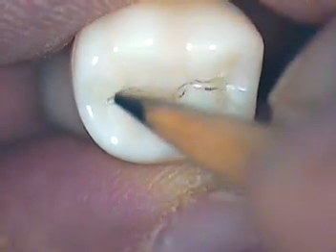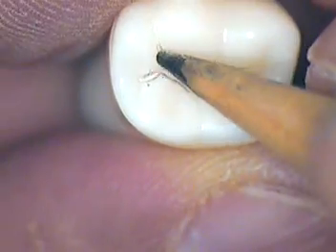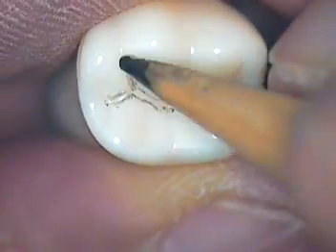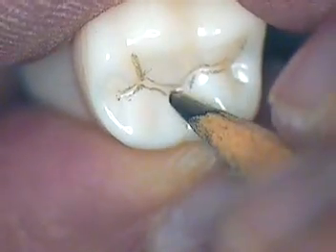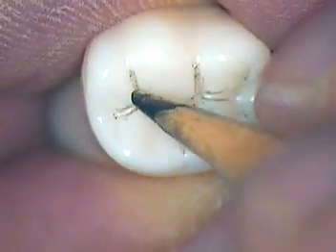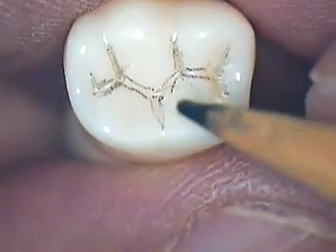It looks kind of like an M shape. Then we're going to have a couple of dovetails — we'll put one in here, one on the mesial aspect. So you've got the distal aspect, mesial aspect, toward the lingual groove, and of course the mesial buccal groove. You've got the distal groove going a little bit into this area.